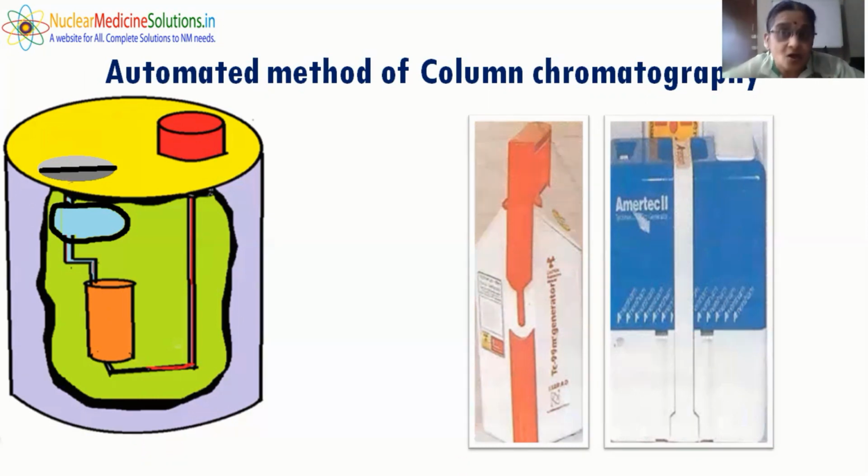Remember, it is very important, so a basic level of simple training is still required for the beginner. However simple it is, please understand the importance of each step, and accordingly, the beginner has to work with it. So this saline bag is already inbuilt in the generator, and that gives the name wet generator to this kind of column chromatography generator.